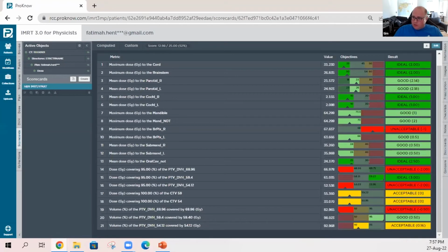Let's just go with one from Gazim about scheduling the boost fractionation for VMAT. They asked, should boost fractions be included together with PTVs or separate? So basically SIBs or sequential boost volumes, if you could talk a little bit about that.